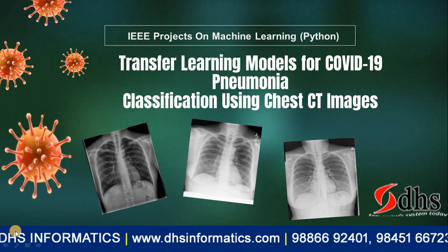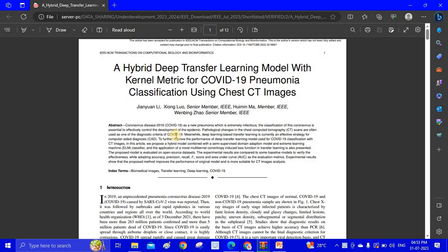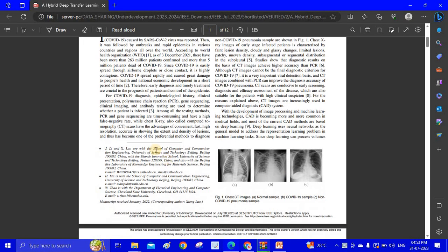This title and project are inspired by an IEEE paper, and I show the paper here. And this is that paper, year 2022.